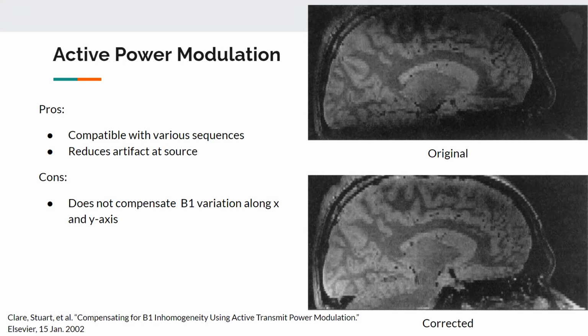And it's important, especially when accurate flip angle is critical for the image that's being acquired. And also, moving on from that, even though this technique is used to compensate for B1 variation only along the z-axis, it's still pretty significant because in the paper it was shown that B1 inhomogeneity is most dominant along this axis. So it was right to focus on this axis.